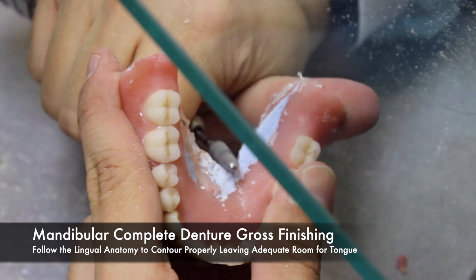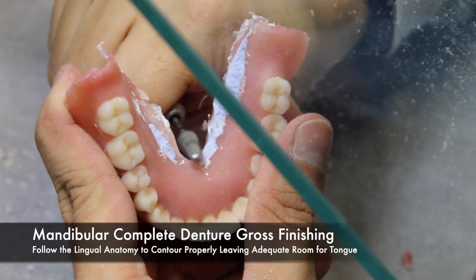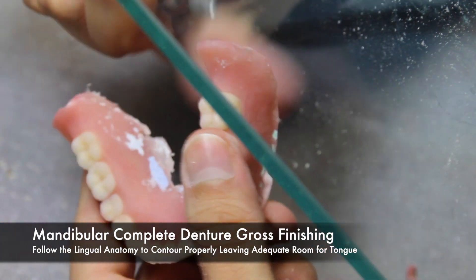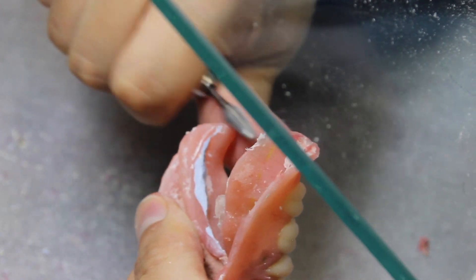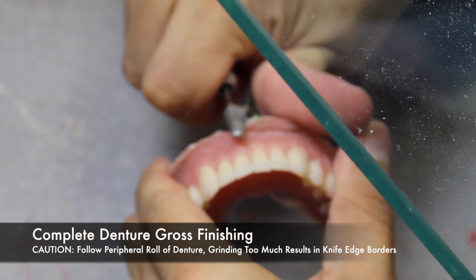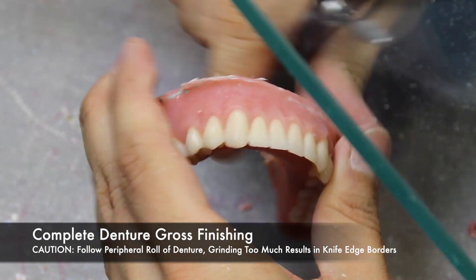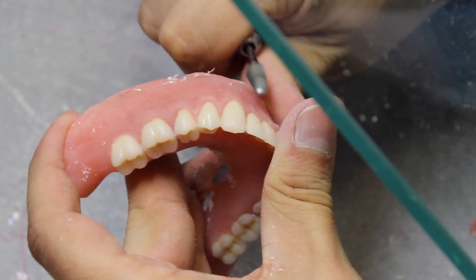When finishing the mandibular lingual side of the denture, follow the lingual anatomy to contour it properly, making sure that you leave adequate room for the tongue. It's important to also pay attention to the lingual frenum. When the tongue moves and the frenum hits the denture, chances are the denture will move as well. When rounding borders, it's important to follow the anatomical structures captured during packing. If the borders are ground too thin, they become a knife edge and can no longer be rounded. Take caution when thinning borders.